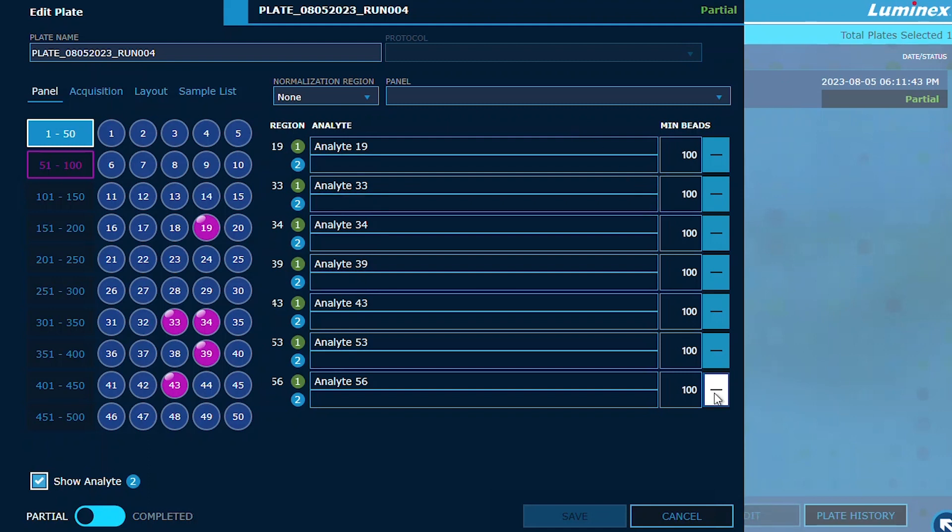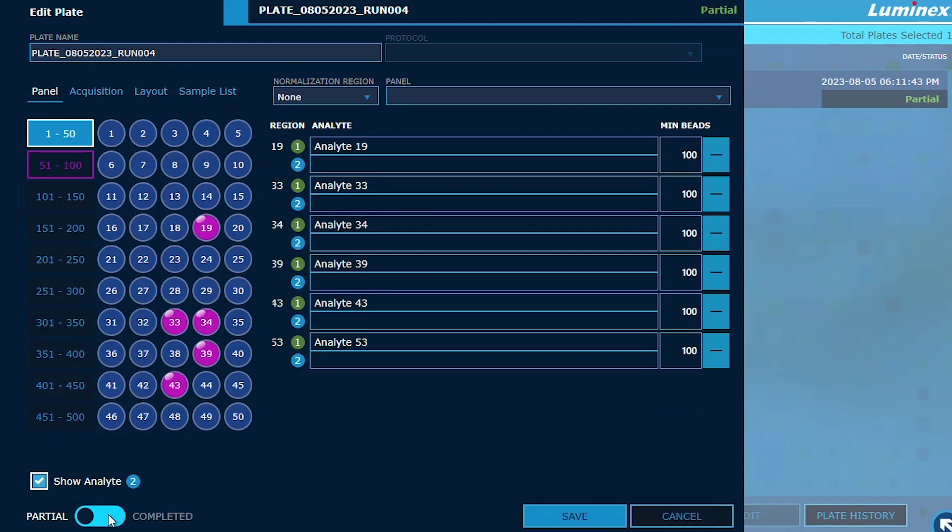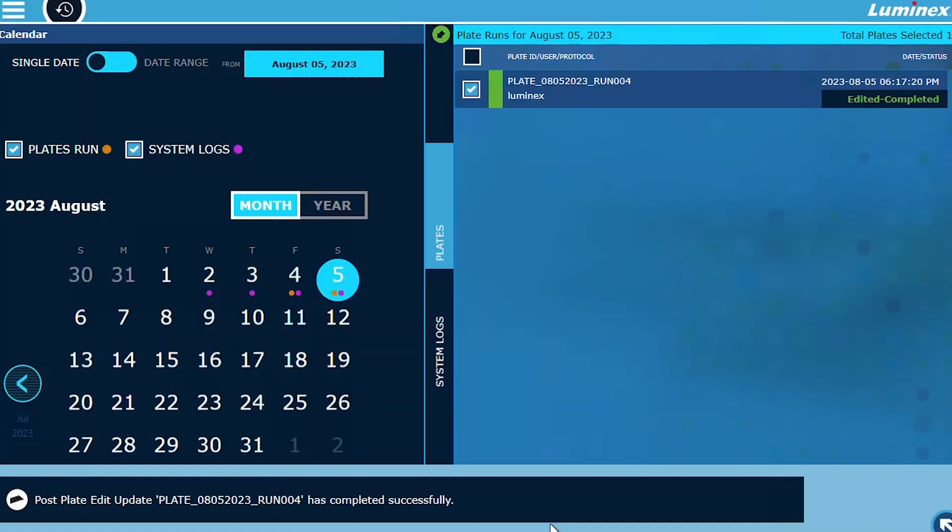Additionally, using the Edit function, you can now mark partial plates as complete, easily removing unacquired wells from your data.